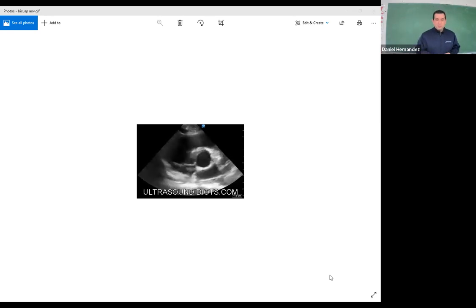So with aortic stenosis, we can also potentially see dilatation of the aortic root. We can also potentially see left ventricular hypertrophy, which could eventually lead to left ventricular chamber enlargement as well, but definitely hypertrophy first. So just keep those things in the back of your mind. Definitely aortic root dilatation, because you have that post-stenotic dilatation associated with it.